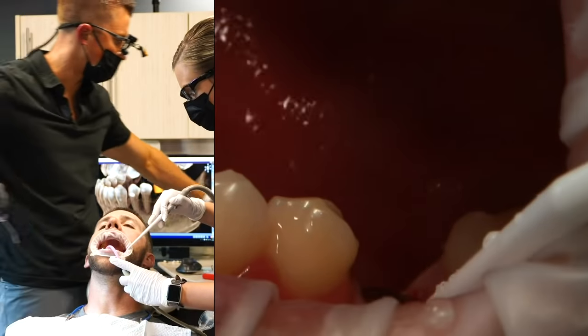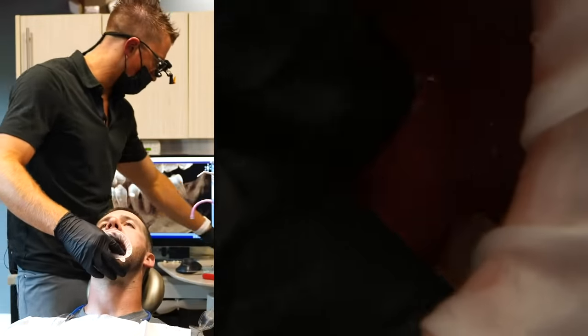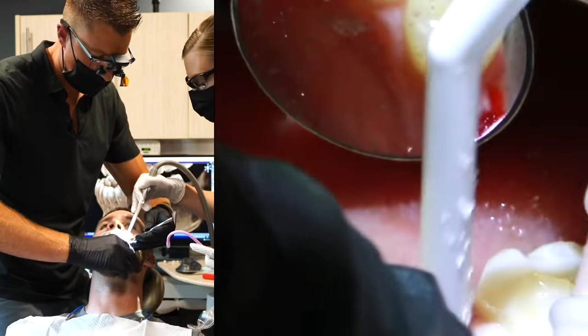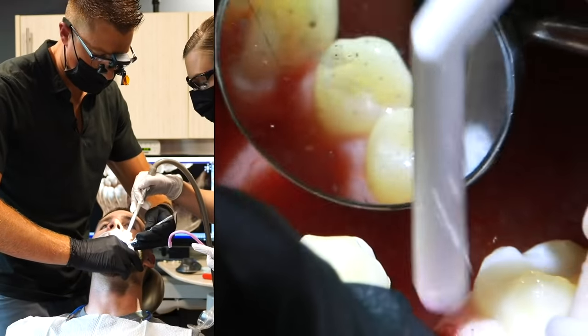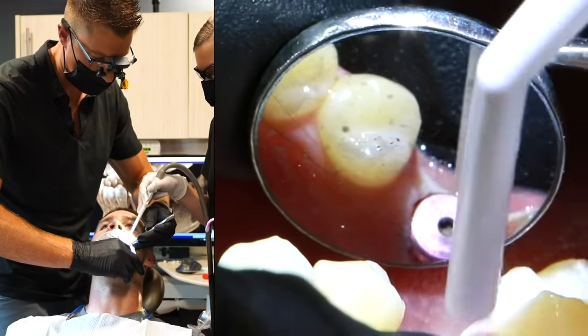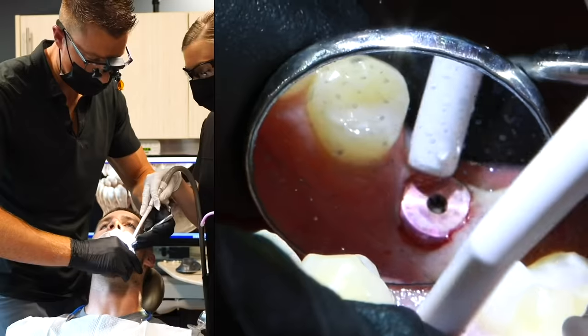So I didn't time it, but we obviously were talking. The goal is to be informative, but I wanted at least, you can go ahead and give suction. So you can kind of see very minimal bleeding. He'll stop in just a minute or so, but you can see off my mirror here. Can you see, Michael? Yep. There's our implant in place.